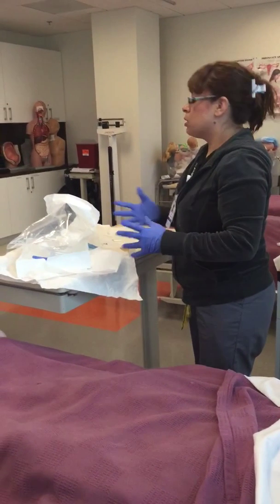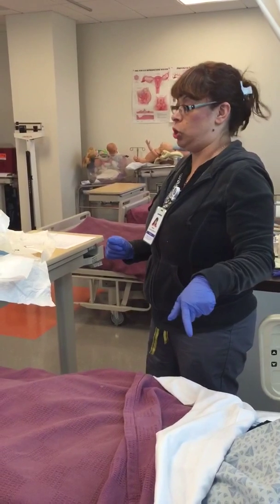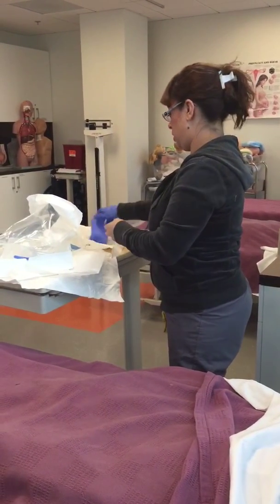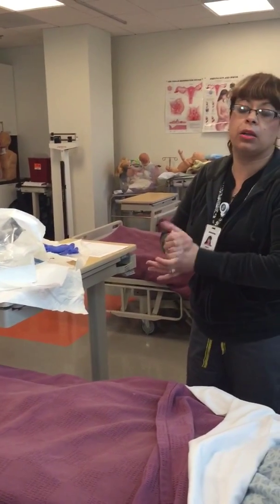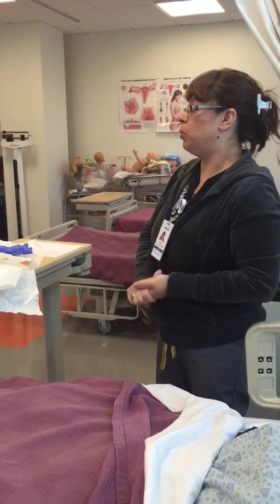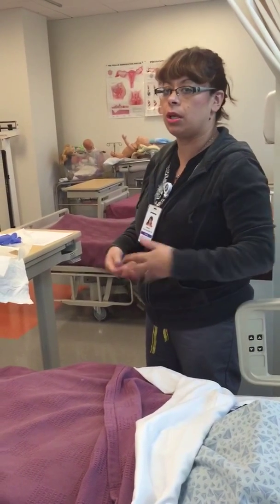Okay? So now let's say a few days went by and she's post-op day number 2. She has an order to get her Foley catheter out, because you have to get it out as well. So you're going to come back in and check your doctor's order. If the catheter has been placed by your urologist, you never remove that. It has to be removed by your urologist. But if it was placed by nursing, nursing can remove it.